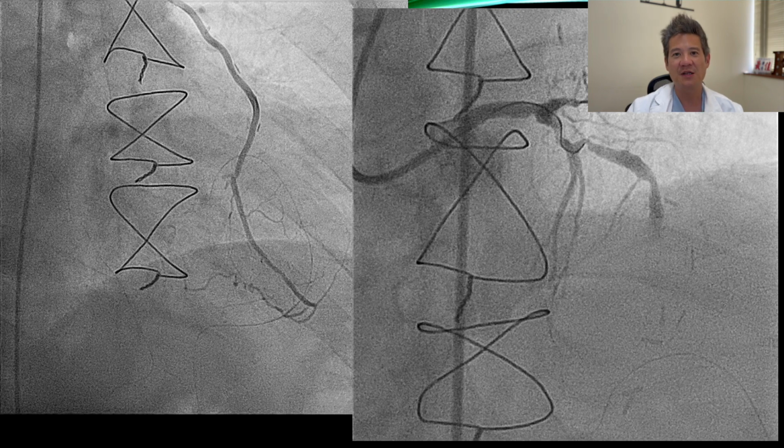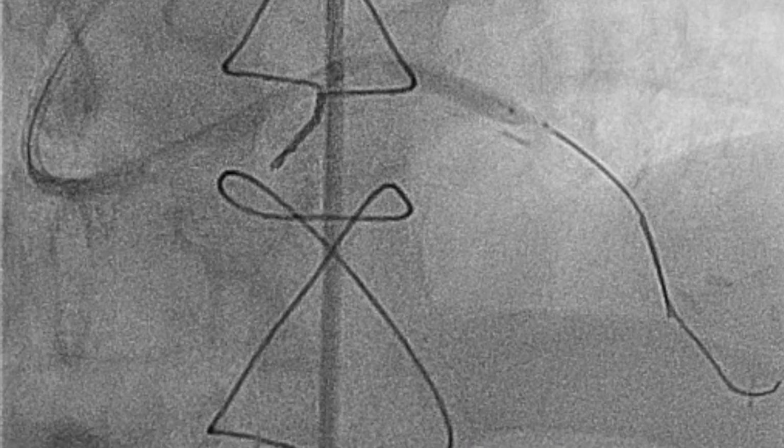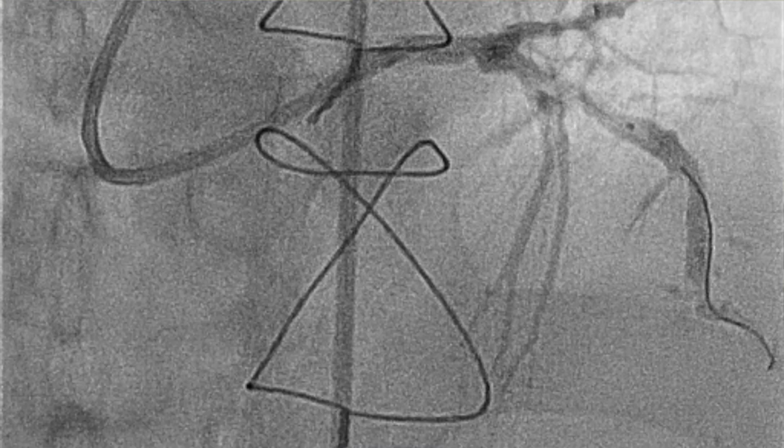At this point, we decided to undergo PCI to try to treat the proximal LAD lesion so that we can open up the septal collaterals to go retrograde to do the circumflex CTO. We're hoping to do all of this in one sitting. Unfortunately, the fellow who was doing this struggled tremendously with the proximal LAD, and required a buddy wire system to get a balloon down even to balloon the LAD.